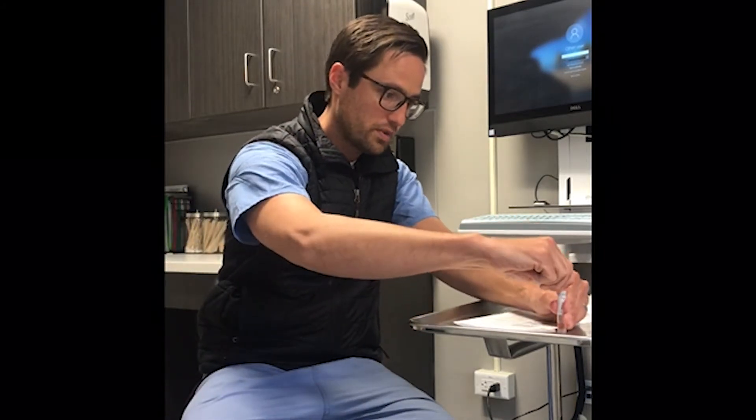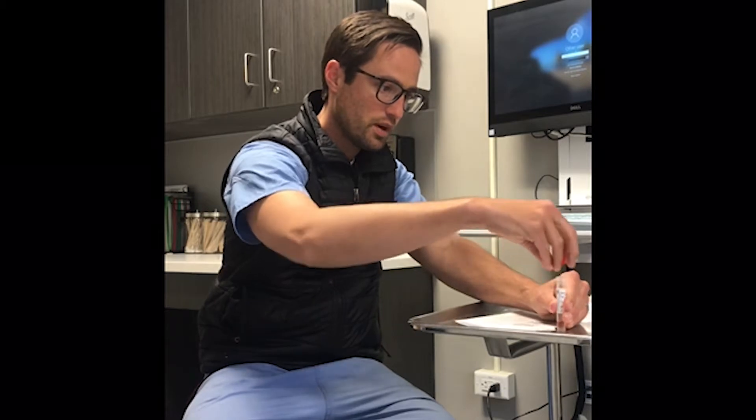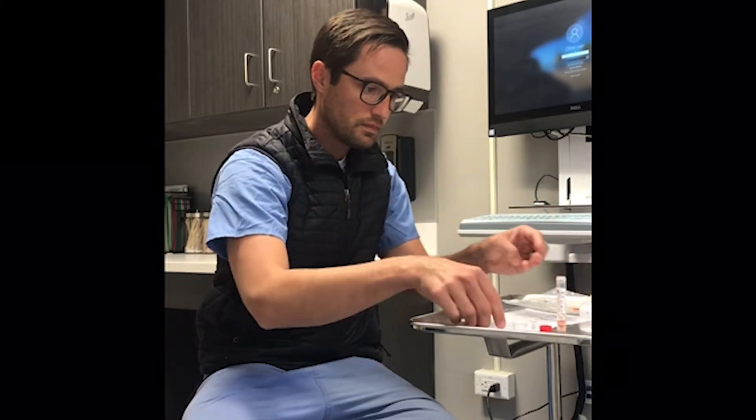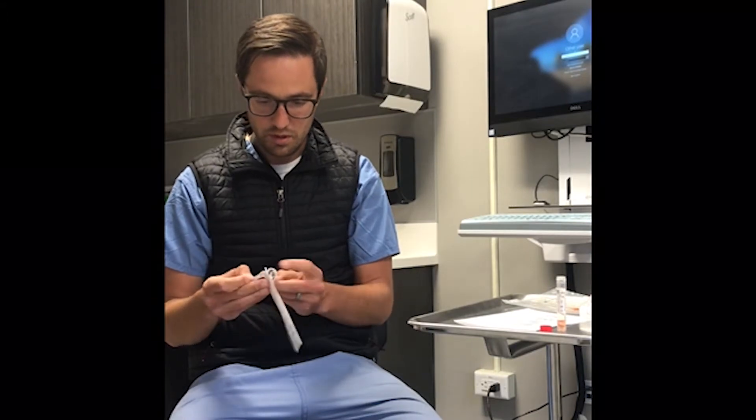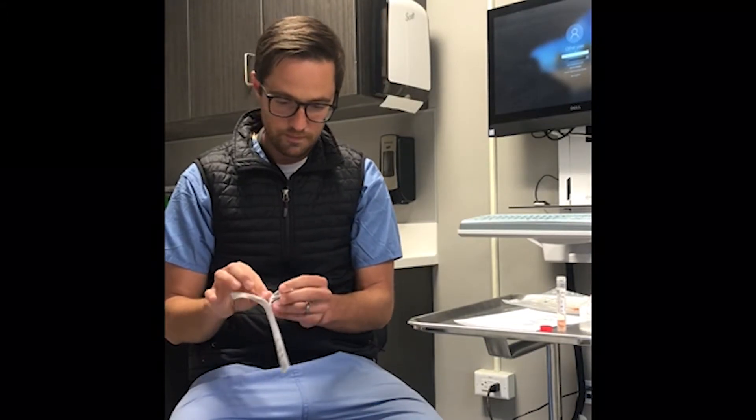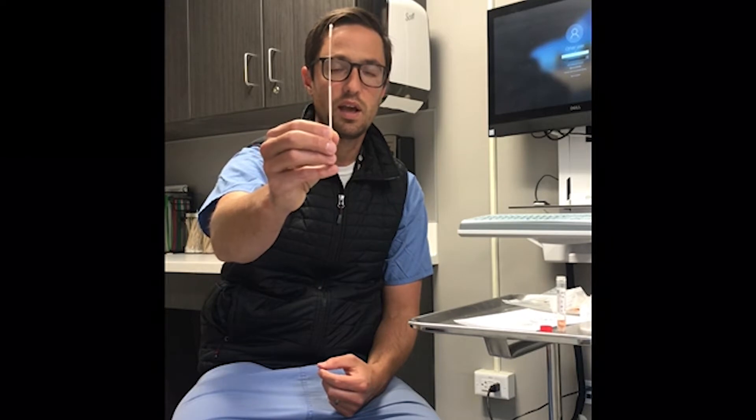Go ahead and gently open the collection tube and have it ready. Then gently open your swab, trying hard not to touch the cotton end of the swab. About two-thirds of the way down the swab is a red line with a small score there. Keep your fingers below that score line if possible.